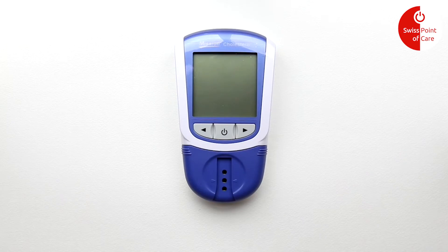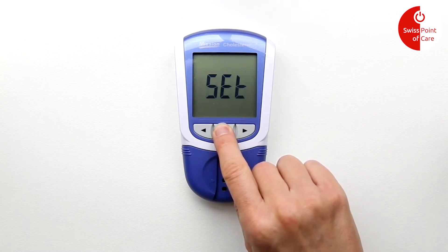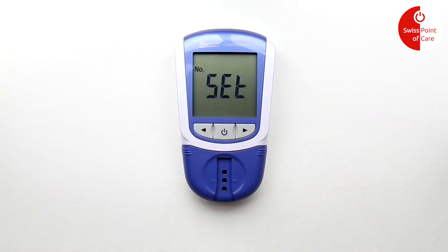Before the first use, your meter must be configured. You only need to do this once. Press and hold the power button for 4 seconds. The meter will now display 'no set'.